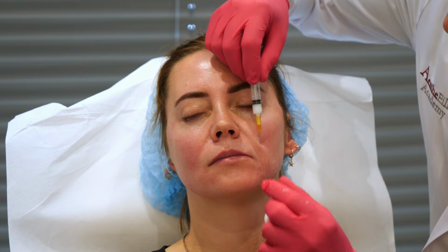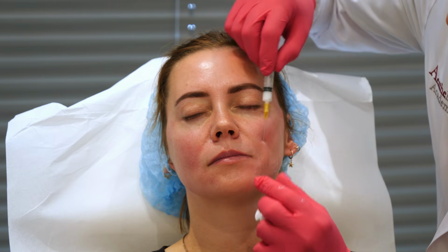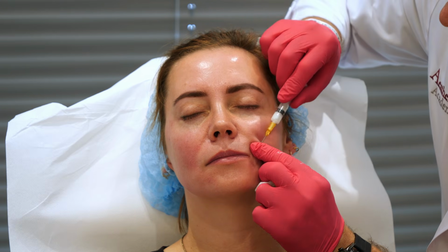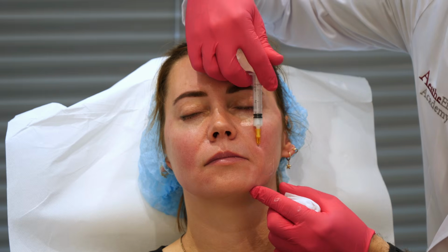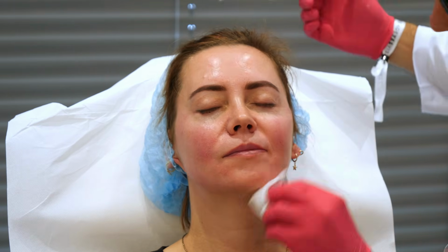Slowly, I make a substitution, and I will put a little amount of product, about 0.2. Fine. This is the last, no? Yeah. Okay.